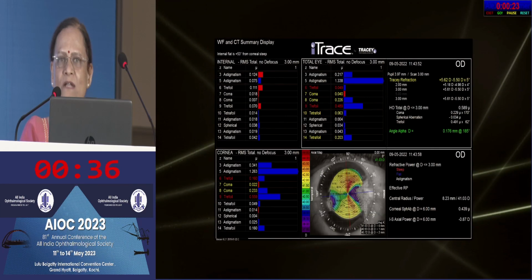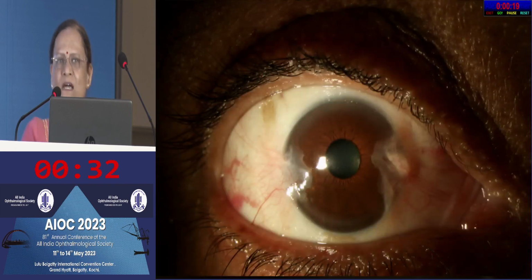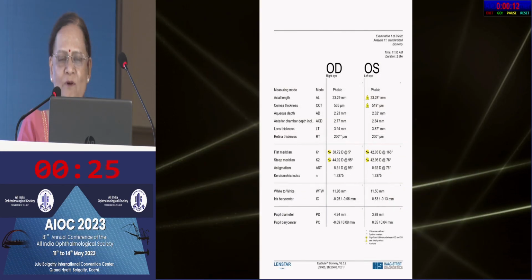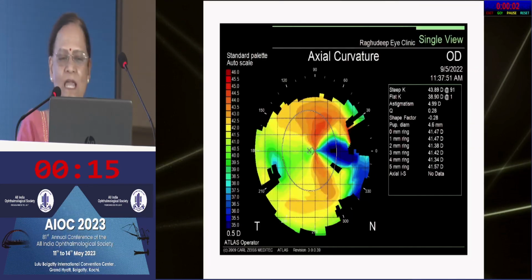These are the higher order aberrations and the high astigmatism. This is the quality of her vision. The simulated E-chart shows you the quality of her vision, and such poor vision she had. We did the Scheimpflug, almost 6 diopters of astigmatism. And if you see, this is showing, if you go ahead with this without removing the pterygia, it's showing you a 24 diopter T8. Okay.